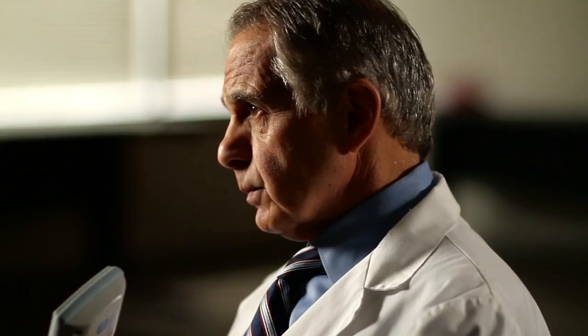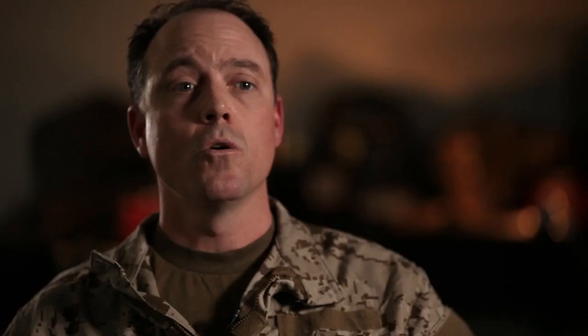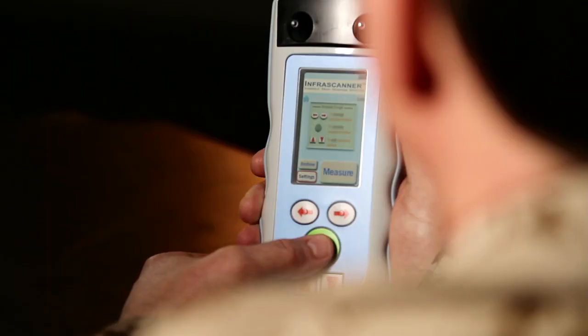The first thing you want to do is make sure that the system is fully charged or has fresh double-A batteries. The system provides an hour and a half on the rechargeable batteries and up to two hours with the double-A batteries. The battery indicator light is located in the top right of the screen. If you see a low battery indicator, you have approximately one to five scans remaining.